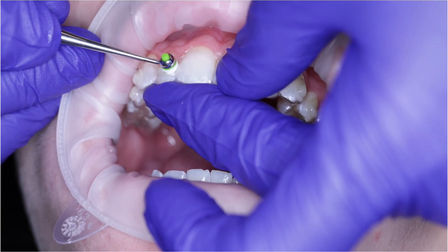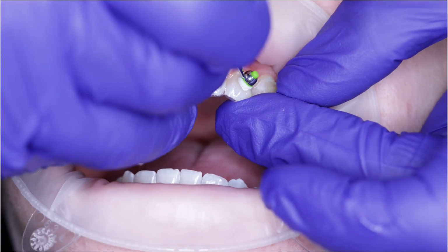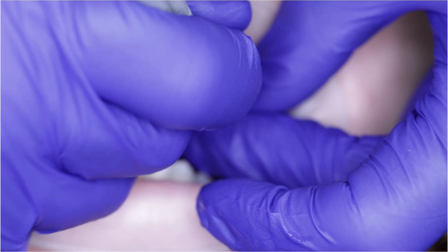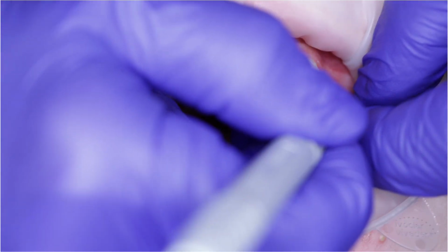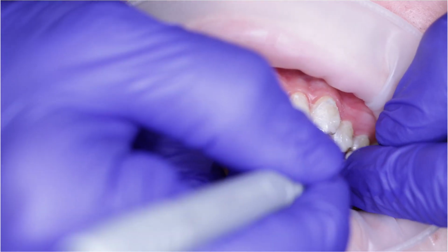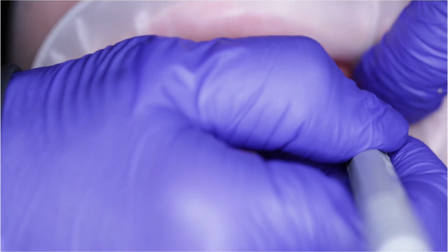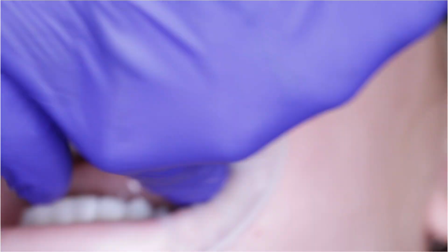Now, why do I do that? You say, Shannon, why do you do that? Because what we find is that when we seat the attachment template onto the patient's teeth, some of the composite will actually squeeze out. By tracing the attachment and going around it with the OptraPad, we find that it actually scoops that composite back into the attachment window, which is what we want. And so this is where I'm going to go around and I'm going to trace every tooth and just make sure it's down all the way.